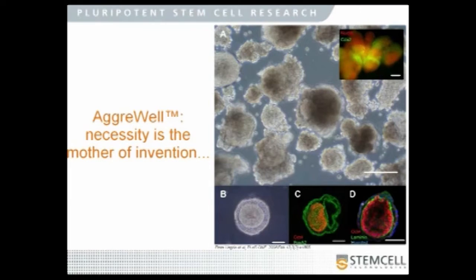And I started following up with a bit of immunofluorescence. And it appeared that the inner ball consisted of OCT4 positive cells, while the outer shell was cells positive for endodermal markers such as FOXA2 and so on. And the two layers were separated by a laminin-containing basement membrane.